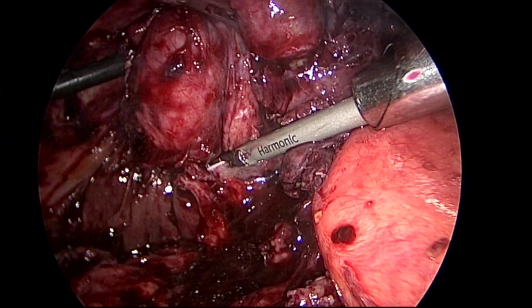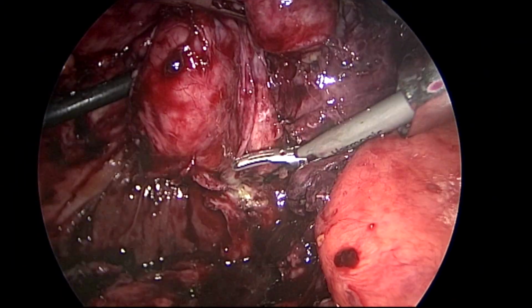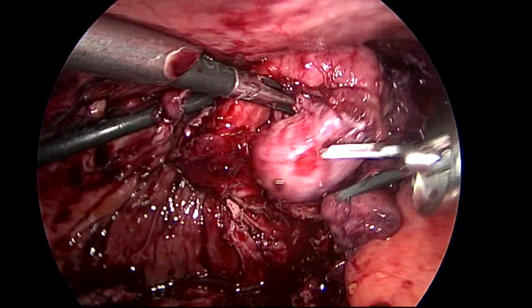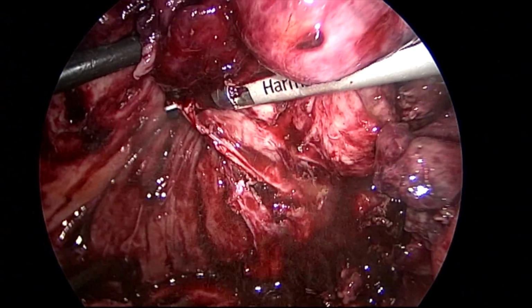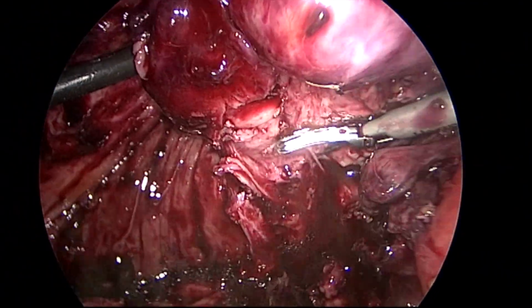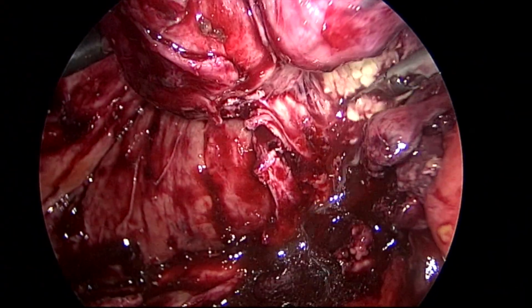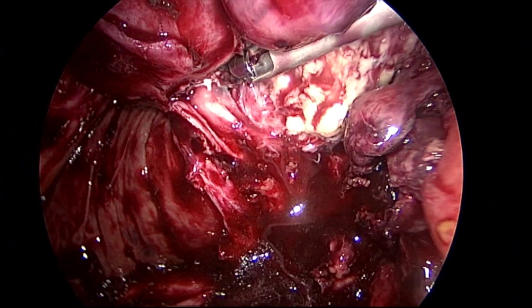I am not leaving any gallbladder mucosa, only the posterior serosal wall is being left behind on the liver bed. So only the type 1 cholecystectomy I am doing here. If I try to remove the posterior serosal wall of the gallbladder, then a lot of liver surface will be injured, so I left behind the posterior serosal wall.